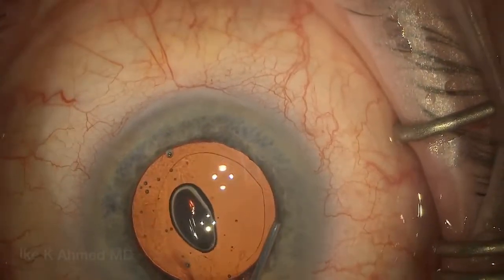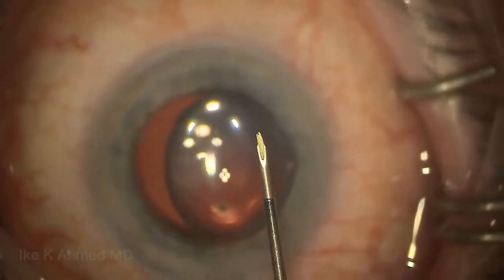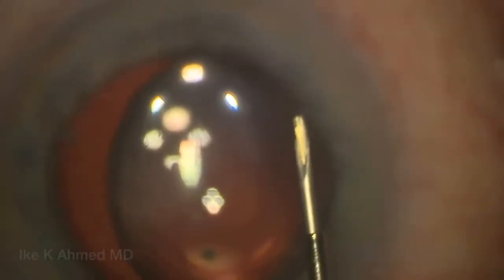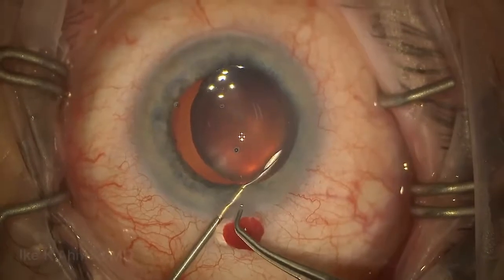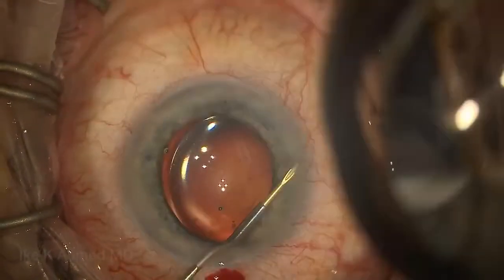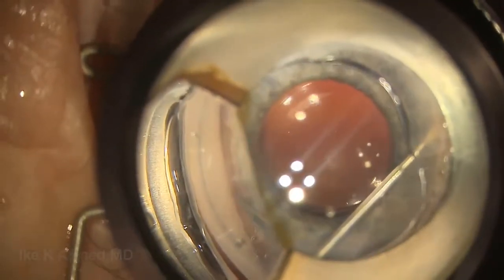Once the cataract extraction and lens implantation has been performed, we'll leave the OVD in the eye while injecting some Helon GV — I find that keeps the anterior chamber well formed. Here's the Zen implant on a 27-gauge needle. We'll pass it through the main incision, lifting up slightly with a pair of forceps, placing the needle toward 12 o'clock to enter the angle at 12 o'clock, aiming to the supranasal quadrant using a gonio mirror.